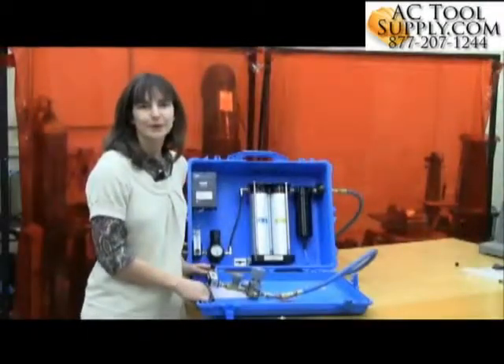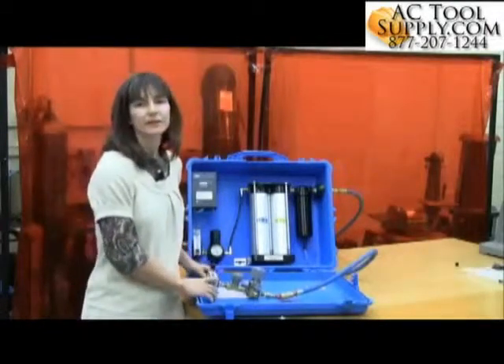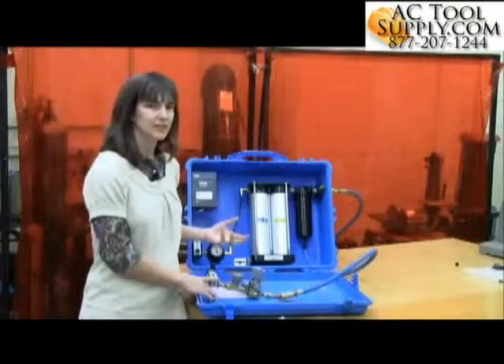Today I'm going to show you how to test for Grade D breathing air using the colorimetric test method. A colorimetric test kit will be different depending on the manufacturer you purchase it from, but the procedure will be essentially the same.